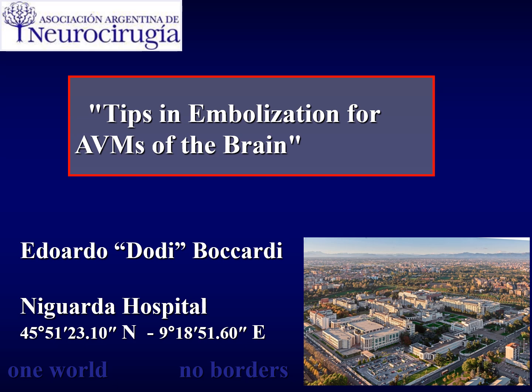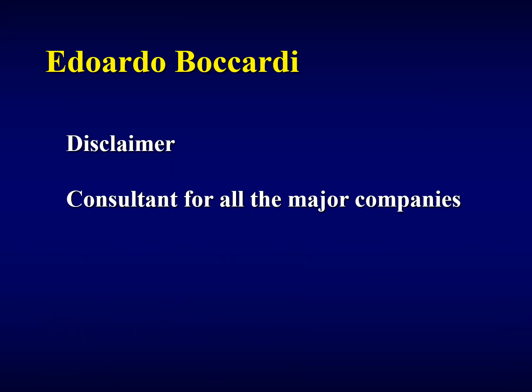I'm very happy and really honored to be here today to talk at the Congress of the Asociación Argentina de Neurocirugía about some tips in embolization for AVMs of the brain. These are my disclosures.